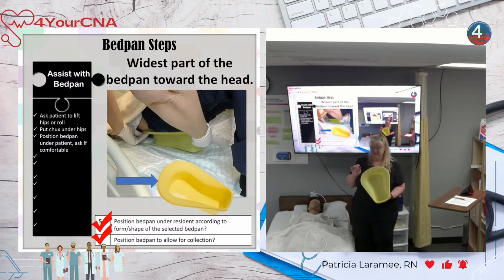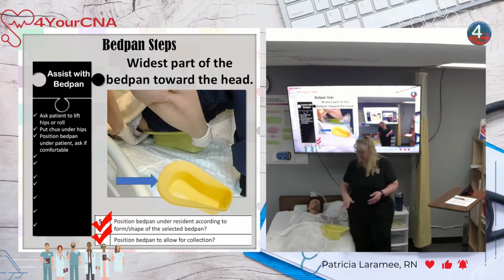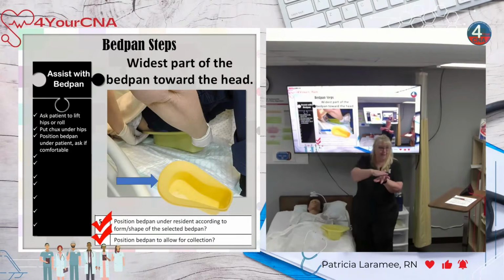Okay? So physics here. Even if you have a splashback effect, because you've got water under pressure, hold that for me, water under pressure hitting that flat plastic surface, it's going to splash back. So the undercarriage of your patient is going to get wet. There's not much we can do about that, except if the nurse tells you or the care plan tells you, there's a cheat you can use that makes this way easier for your patient.